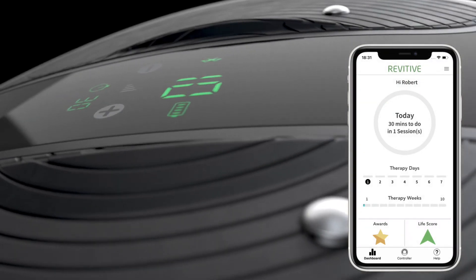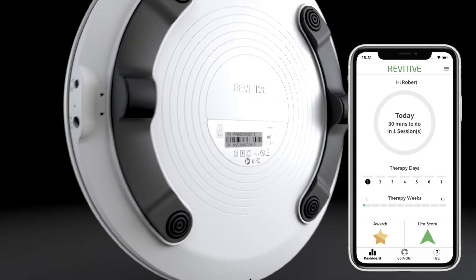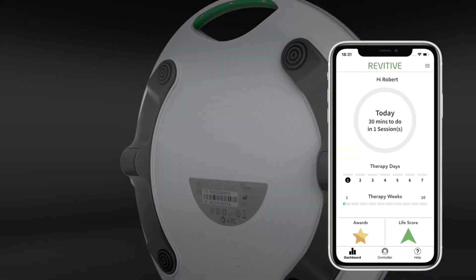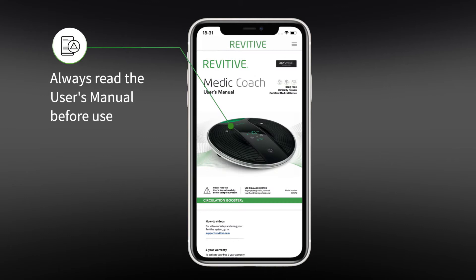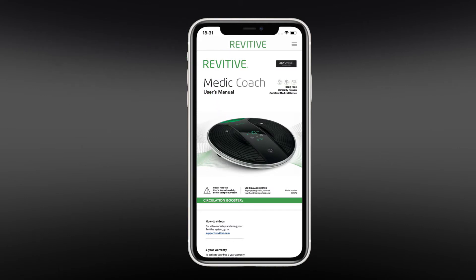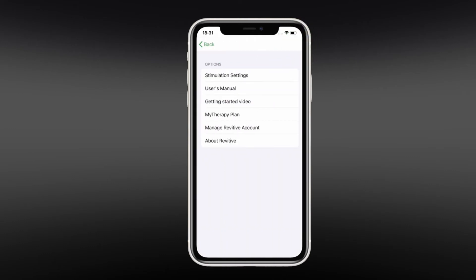This video will help you pair your Medic Coach device with the Revitiv smartphone app and get you started. This information and more is available in the user's manual. Please always read the user's manual before use. You can also access the manual at any time via the app.